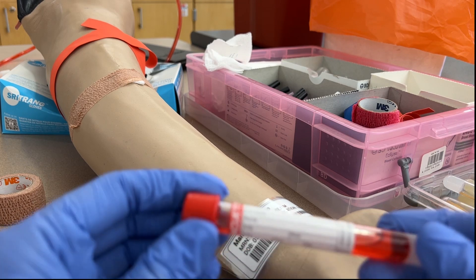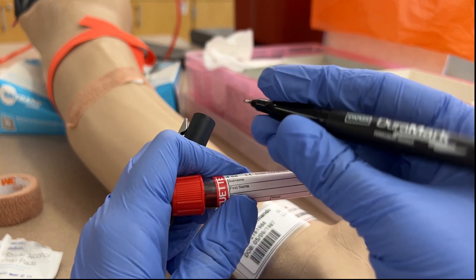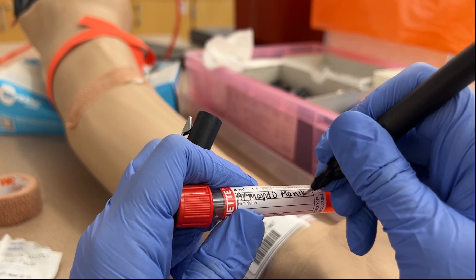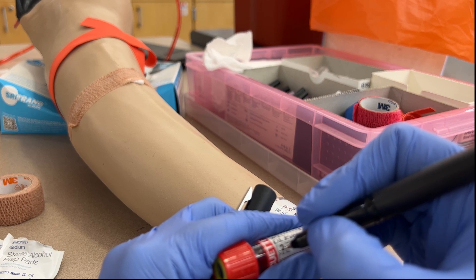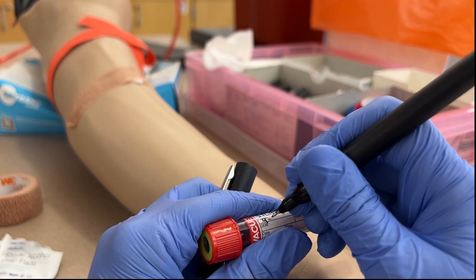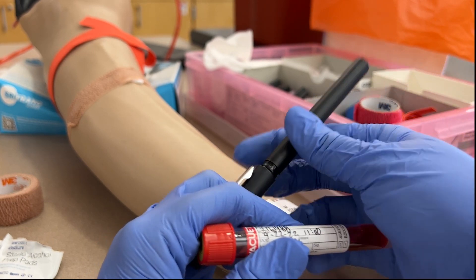Now that we've bandaged the patient, we can label our tubes in the presence of the patient. We need to include the patient's full name — our patient's name is Armando Mannequin and it's important to ensure the name is spelled correctly — a unique identifier such as the medical record number, date of birth, or address, as well as the date and time of the collection and the initials of the collector. Most hospitals will utilize a barcode system where this information is included in the barcode.